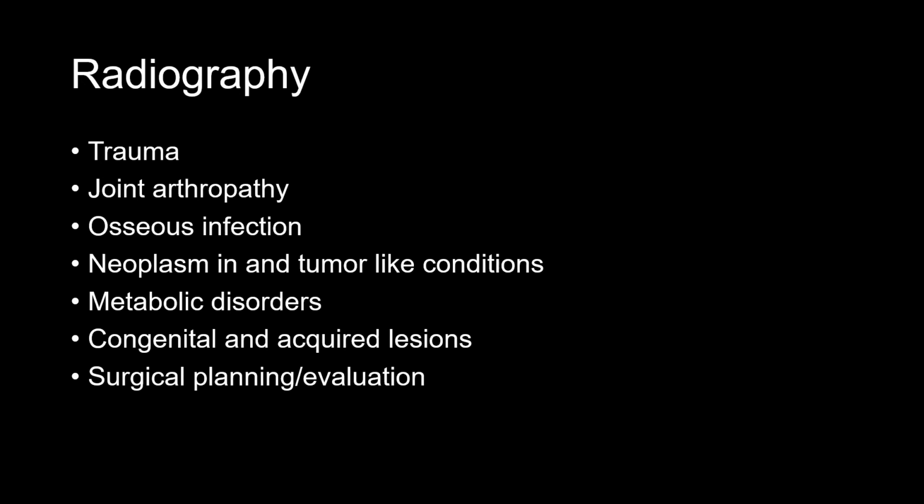First modality we'll be talking about is radiography. Radiography uses X-rays to capture images of the patient. It's the original diagnostic imaging modality and is the most widely used. It has a wide array of uses, such as imaging for trauma, joint arthropathy, osseous infection, tumors, other types of metabolic disorders, congenital or acquired diseases and lesions, as well as surgical planning and evaluation.